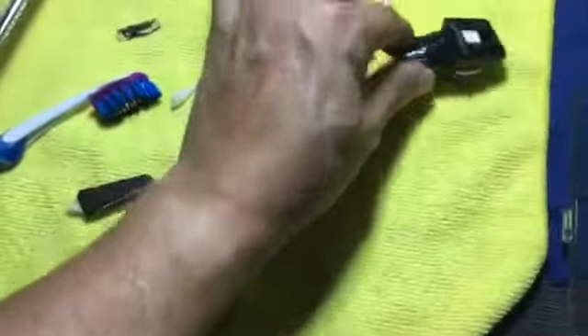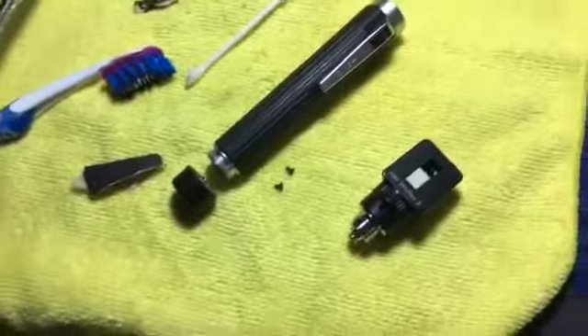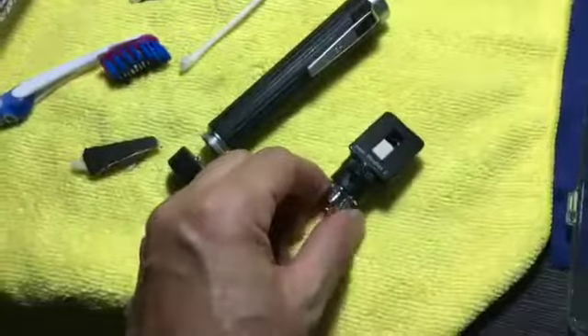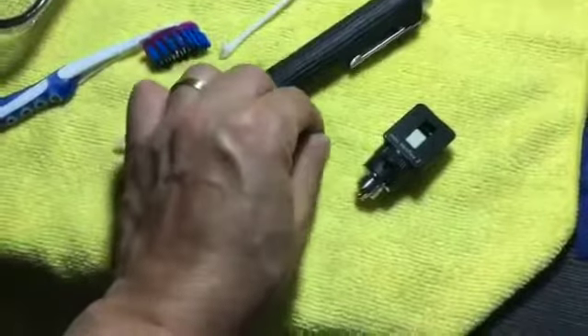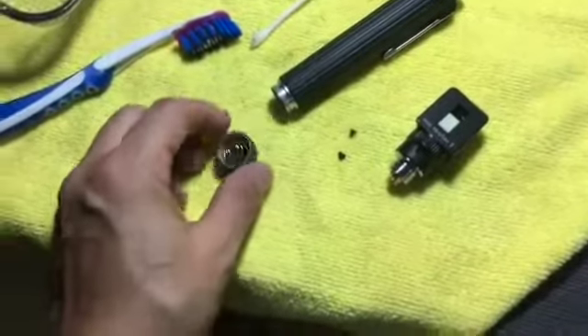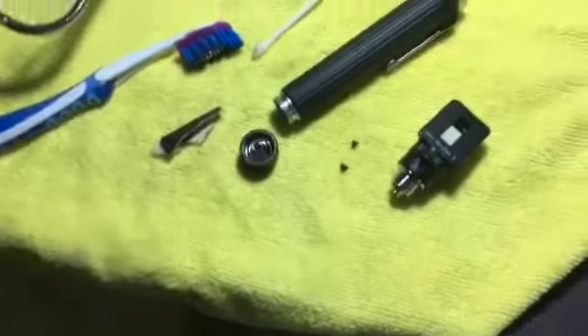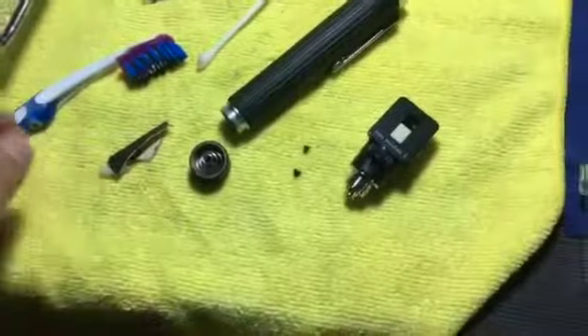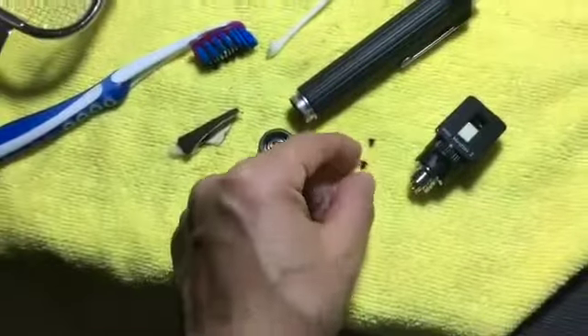If the head is kind of dusty or full of gunk, you might want to take it apart. There is actually no video on how to take this apart, so that's why I'm doing this video for those who like to attempt to service this device at home.